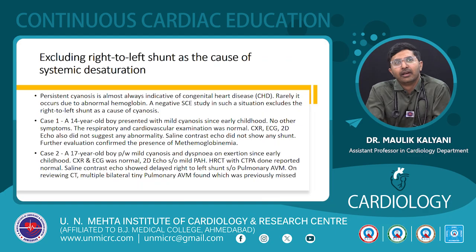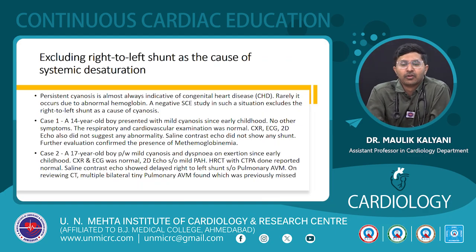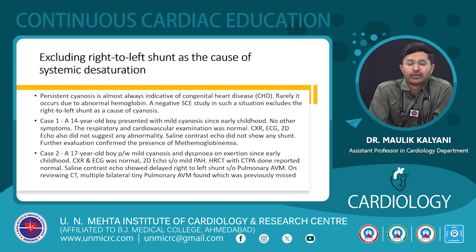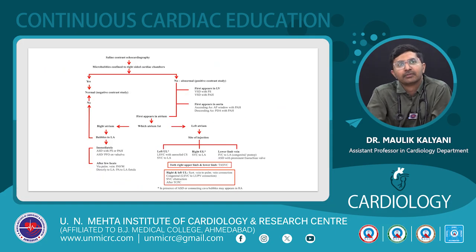So in these cases, when there is desaturation in an otherwise healthy person with all normal investigations, doing a contrast echo excludes right to left shunt as the cause of the desaturation, and we can go for further workup of the other systems.